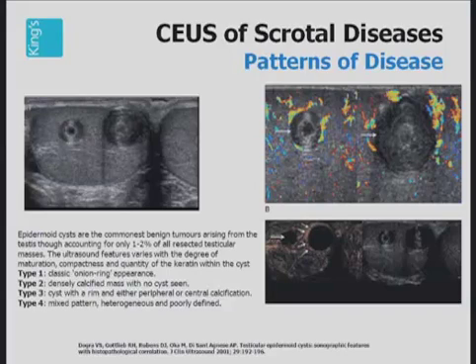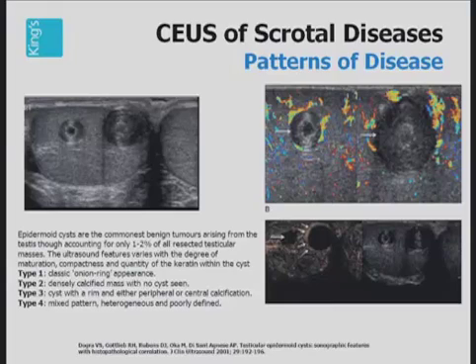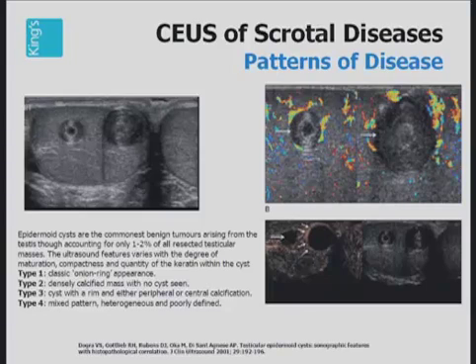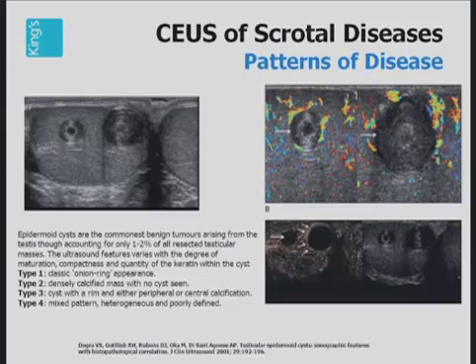Here is another not very common intratesticular lesion, but importantly, benign — this is an epidermoid cyst. Only one to two percent of testicular tumors are epidermoid cysts. There are characteristic features on B-mode ultrasound: the classical onion ring appearance allows the confident diagnosis of a benign epidermoid cyst. However, there are other types: densely calcified cysts, or a mixed heterogeneous poorly defined abnormality. The key to the diagnosis is the complete absence of vascularity. Color Doppler ultrasound is usually very good at showing no vascularity, but the addition of contrast allows greater confidence in interpretation.